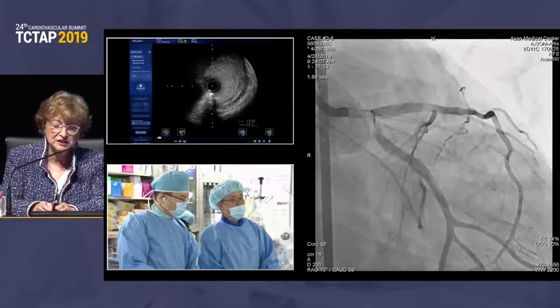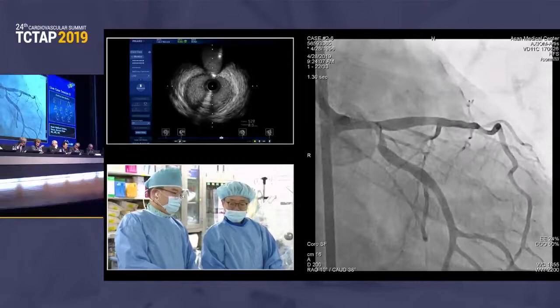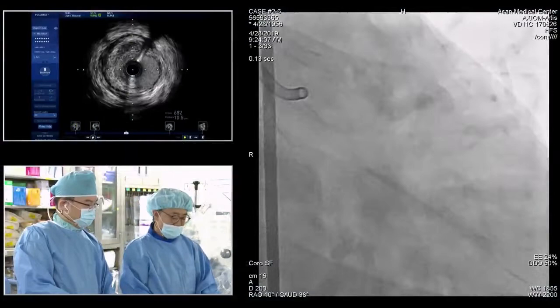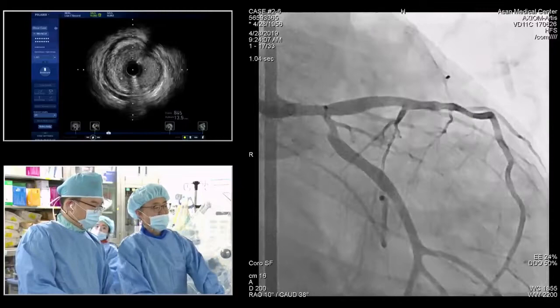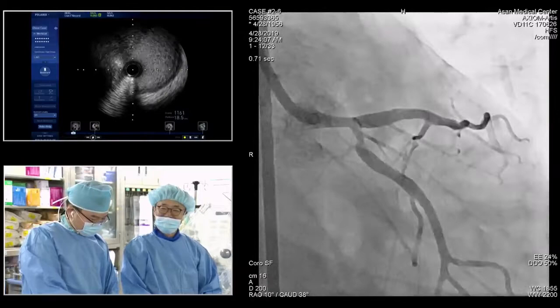And then put a second stent in the LAD only if needed, meaning FFR positive or large dissection. So you would do one provisional stent, yes, though perhaps consider imaging or FFR into the LAD. Is there anyone who's very nervous about jailing the LAD and feels that you must do a two-stent approach in this case? Anybody? One approach, because Japanese DCA is available, would be debulking plus a one-stent strategy, that would be another option.